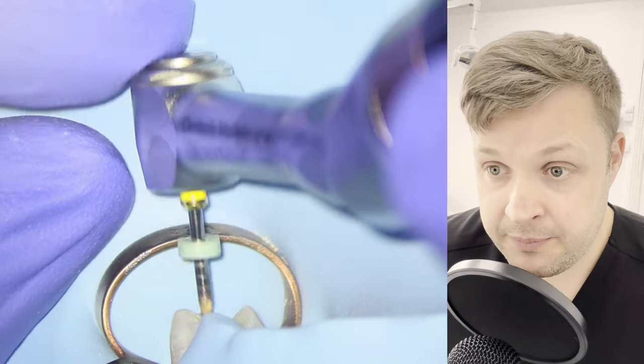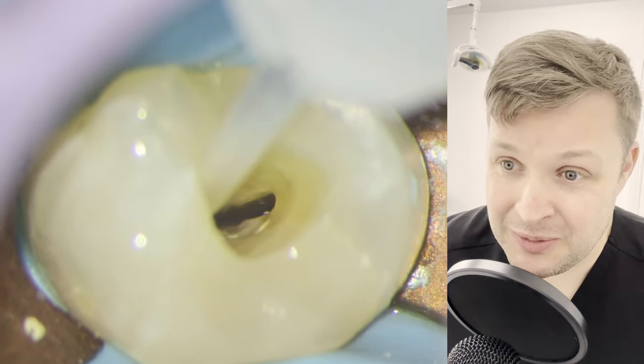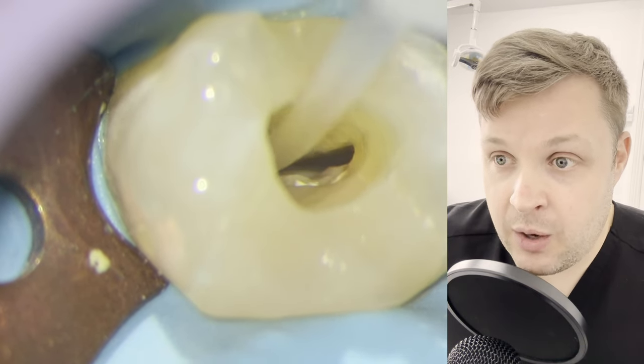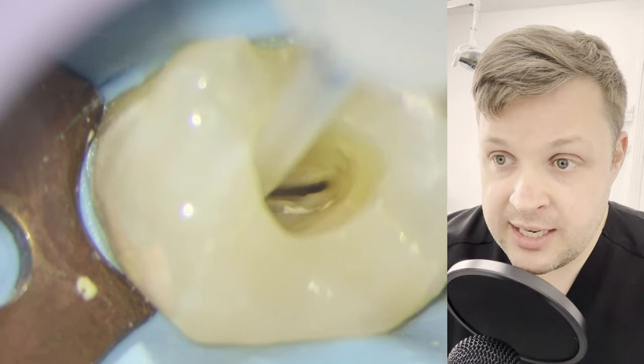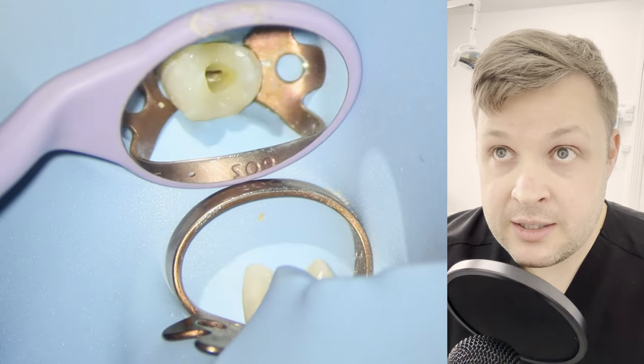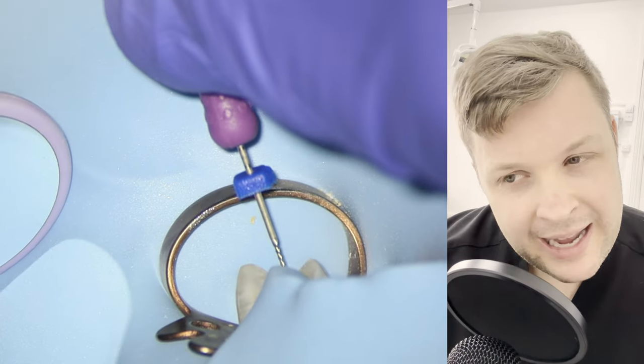What I'm checking now is whether the canals are connected, so I'm just using the hypochlorite. There's a suggestion that they might be connected, but I'm not entirely sure. So once I've shaped the buccal canal, I'm also going to shape the palatal canal.